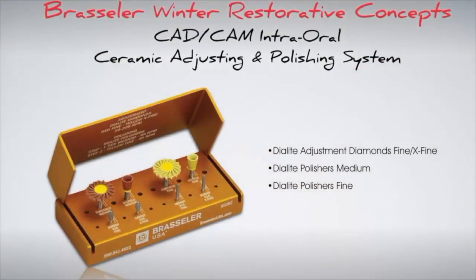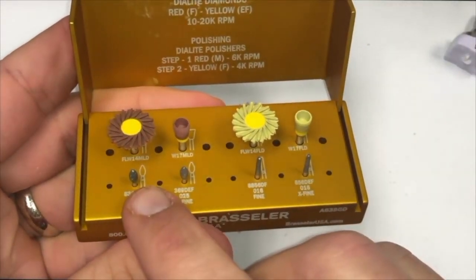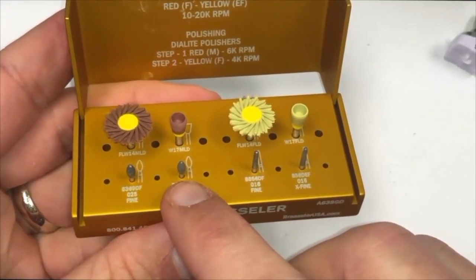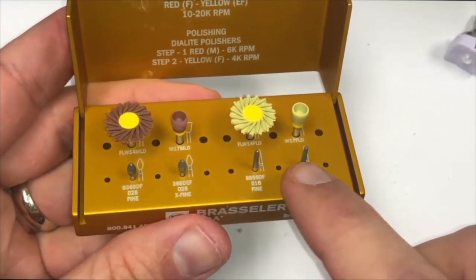Moving on to the CAD-CAM intraoral polishing kit. This kit includes the Dialite diamonds in both fine and extra fine grits, specifically developed for safe adjustments with no microfractures to the ceramic. The kit also includes both medium and fine Dialite polishers to create a natural polish on areas that need refinement. If any adjustments to the occlusion or contours of a bonded or cemented restoration are needed, the Dialite diamonds are used — hybrid particle sized diamonds specifically manufactured for adjustment and polishing of ceramic crowns.